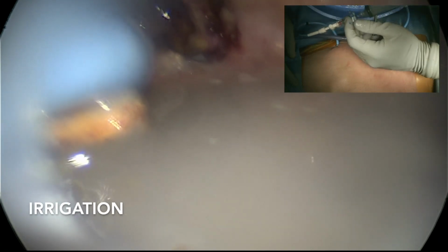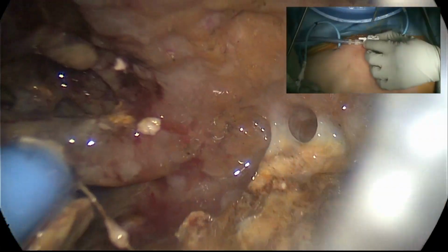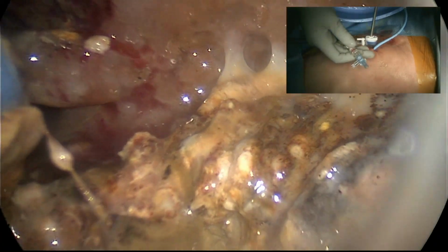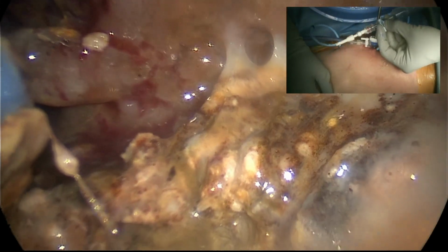The irrigation was continued till we were comfortable that most of the solid debris was taken out. A customized fenestrated drain was placed in the retroperitoneal abscess cavity, and irrigation was continued for 48 hours after surgery. The patient was discharged on postoperative day 3.